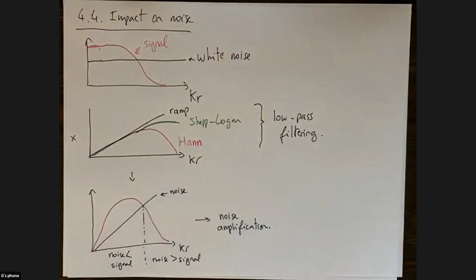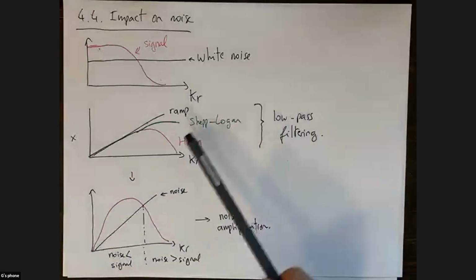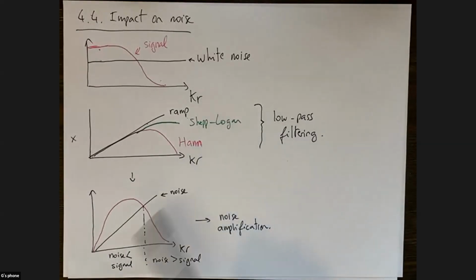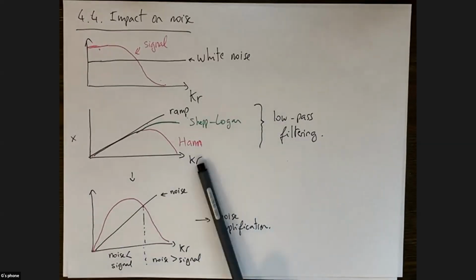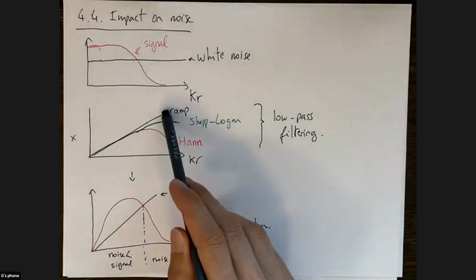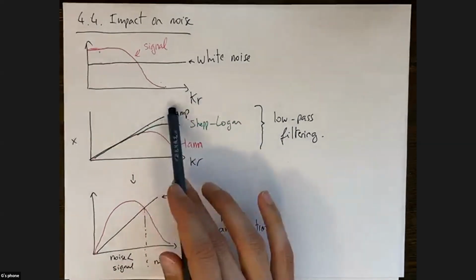Okay. All right, so this is the filtered back projection. Just to recapitulate, the idea requires projections from different angles. We have to filter them, so we apply the ramp filter or a suitable filter that has noise rejection, such as a Han filter. And once the projections have been filtered, they can be back projected into the image one by one. So if a ramp filter is used, and there's no noise, that will give a perfect reconstruction.